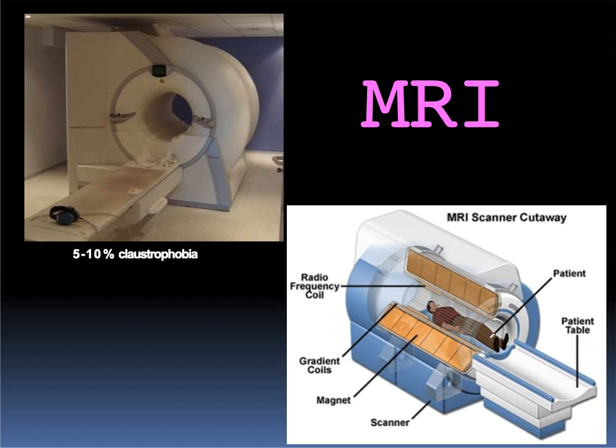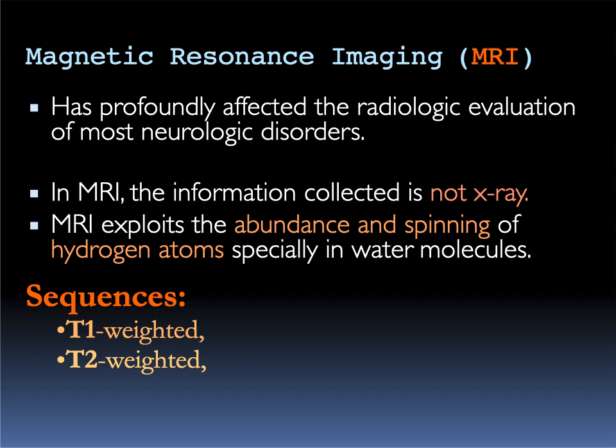And this is the inside and how the MRI scanner works. The CT emits X-rays, and they are detected by detectors. But here it depends on the hydrogen ions inside the body tissue. So we have a radio frequency coil, a big magnet, a gradient coil, and a surface coil. All these can detect the MRI pathologies, and the problem is it takes too much time if you compare it with the CT.